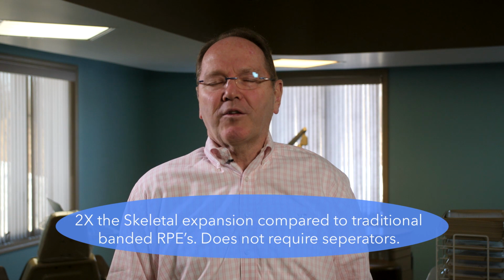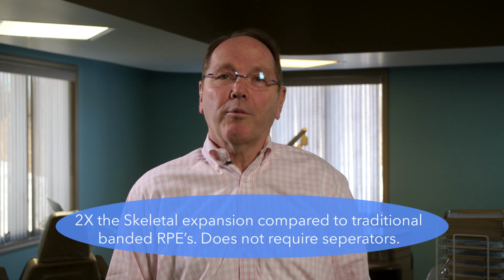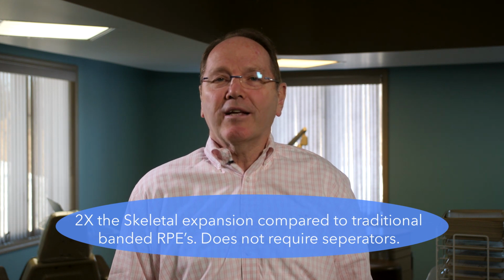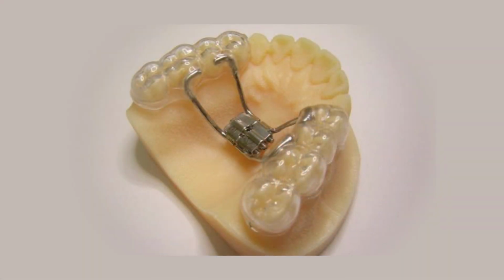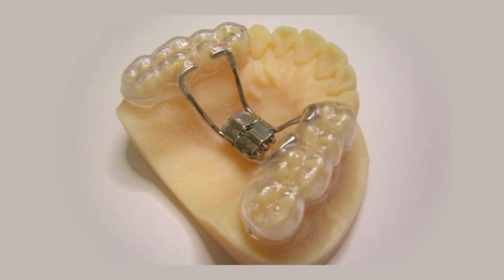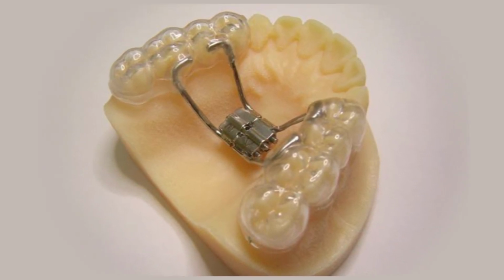The placement of the expander is far simpler with no separators being needed. It places onto the teeth much like a clear aligner or a clear retainer. The only difference is there's a thin coating of adhesive that's painted onto the inside of the expander.